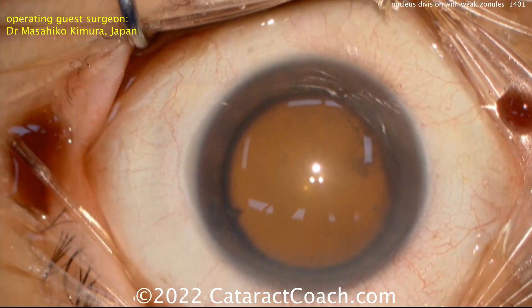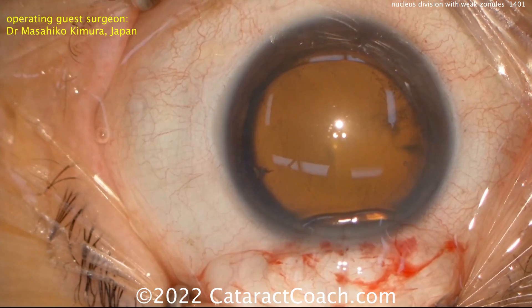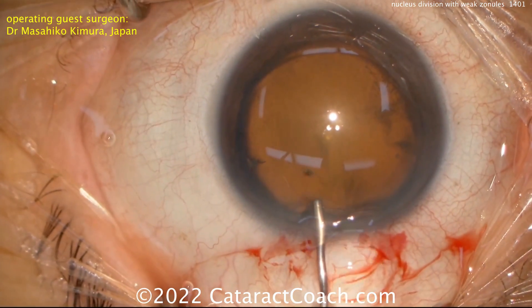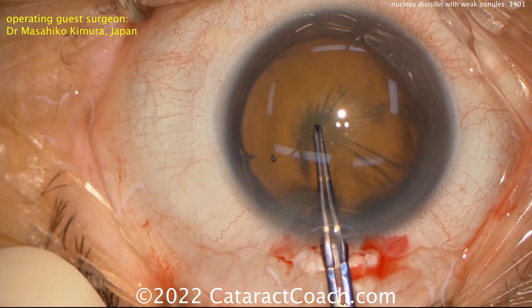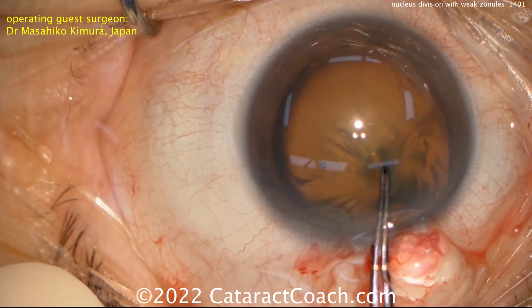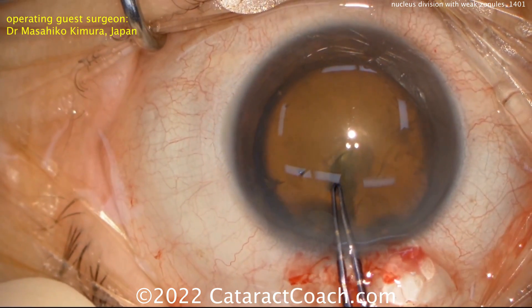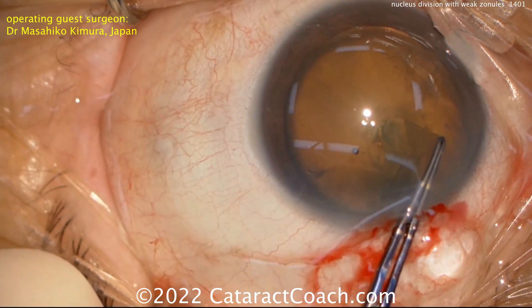Here's another case with weak zonular support. In this case, the V-groove is going to be done. Now the V-groove was described many years ago — the Kelman V-for-victory groove. This was a standard technique of cataract surgery back in the day. You can see as the capsulorhexis is started here, the zonular support looks pretty weak — you saw that wrinkling of the anterior lens capsule.